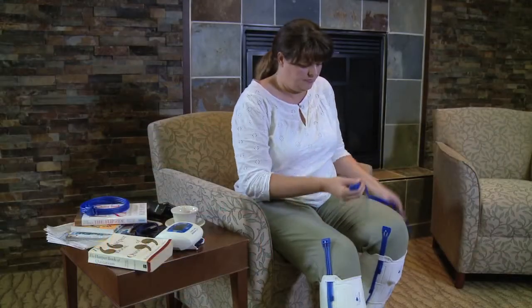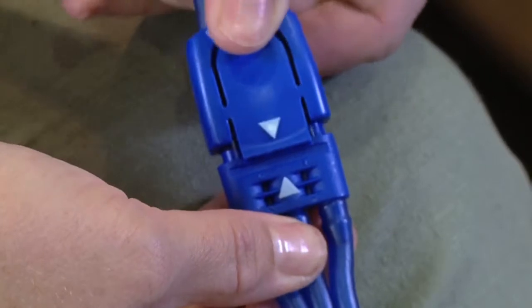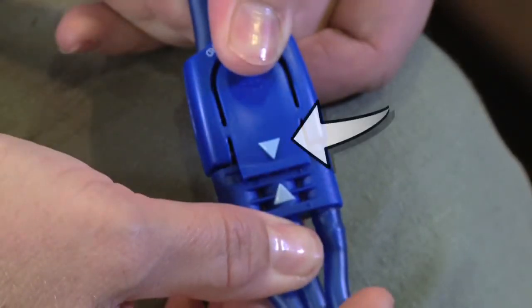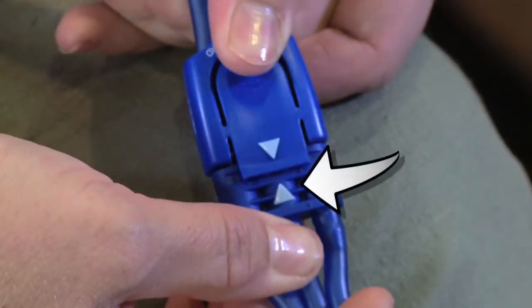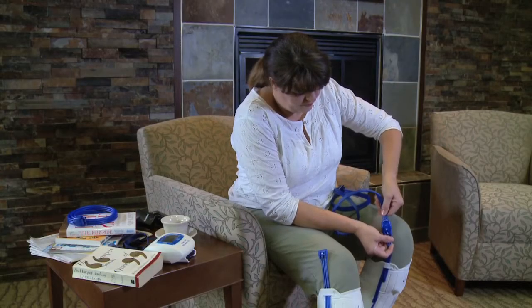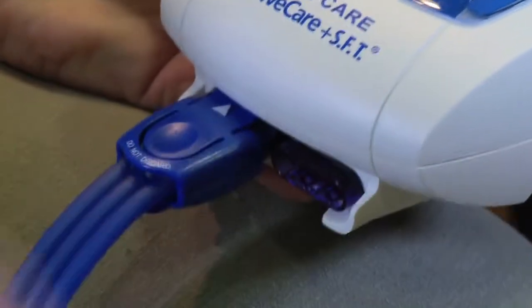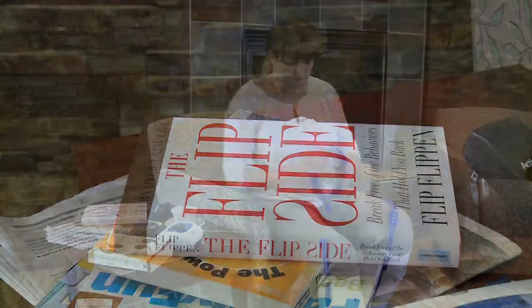Connect one end of the extension tube to the sleeve connector. Find the arrows on each component and connect arrow to arrow. Be sure you have a secure connection at both ends. Repeat for the other sleeve.